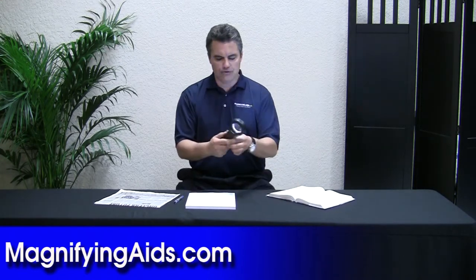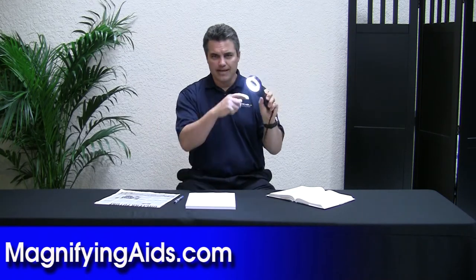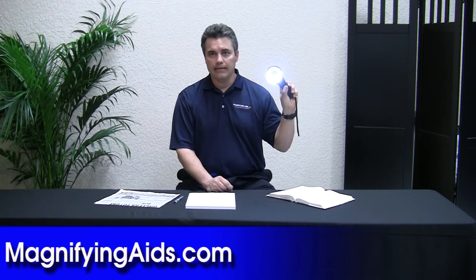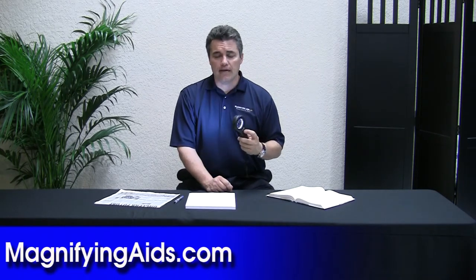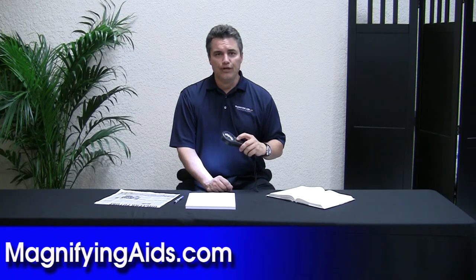Very great product, real popular in the industry, and it's really unique because it has 24 LED light bulbs underneath. If you have any other questions, you can reach us online at www.magnifyingaids.com. Thank you.